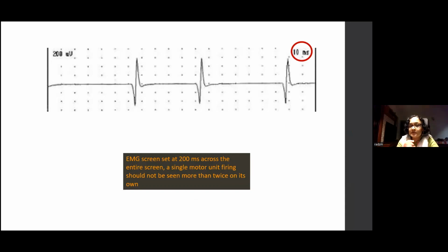Some of the people who have come to the lab, I've seen that it's sometimes difficult to immediately understand what this recruitment is. So they used to ask, what would be an easy way so that we can look at it and get used to it, because recruitment otherwise is very qualitative. You listen to it and you see it and you hear that sound. In the videos you'll hear it, and it's a qualitative sound that you will understand as you get more and more experience.